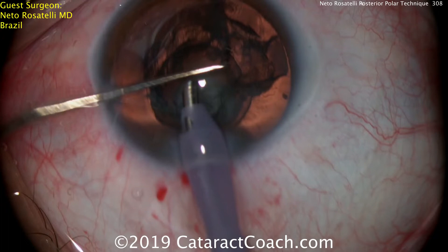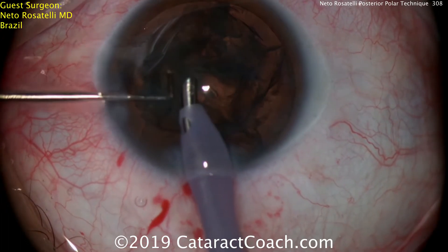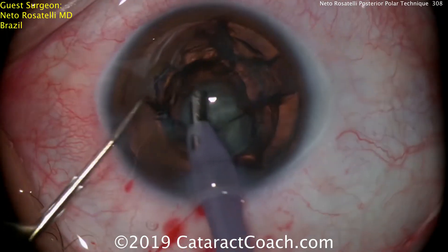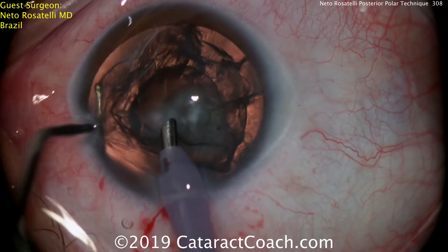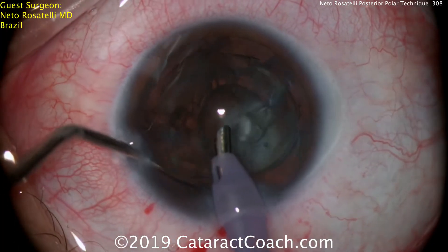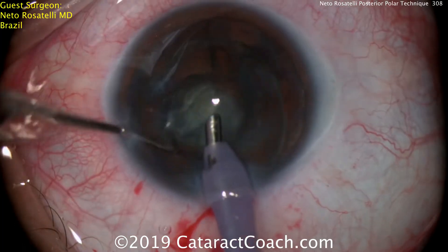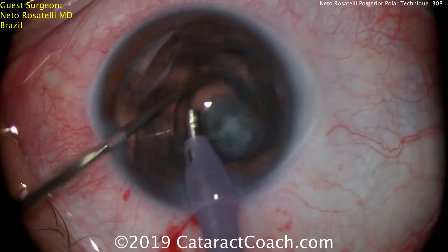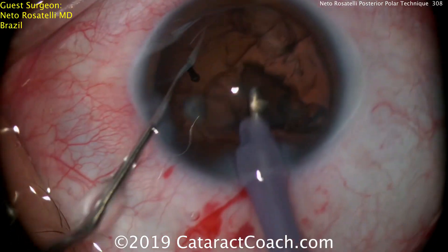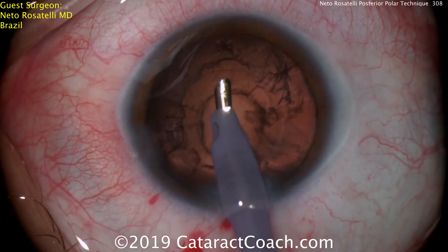This is a very different technique — I thought it was brilliant, I've never seen it before. We've posted many posterior polar videos here on Cataract Coach. In the past, I have used a visco dissection technique to separate that epinuclear shell. But he's simply using the chopper and a little bit of vacuum from the phaco probe, and you can see that just with that, he's able to completely loosen up all of the rest of the epinuclear shell. No hydrodissection at all — he doesn't even do visco dissection. He just uses that chopper to create a plane and dials up the entire epinuclear shell.